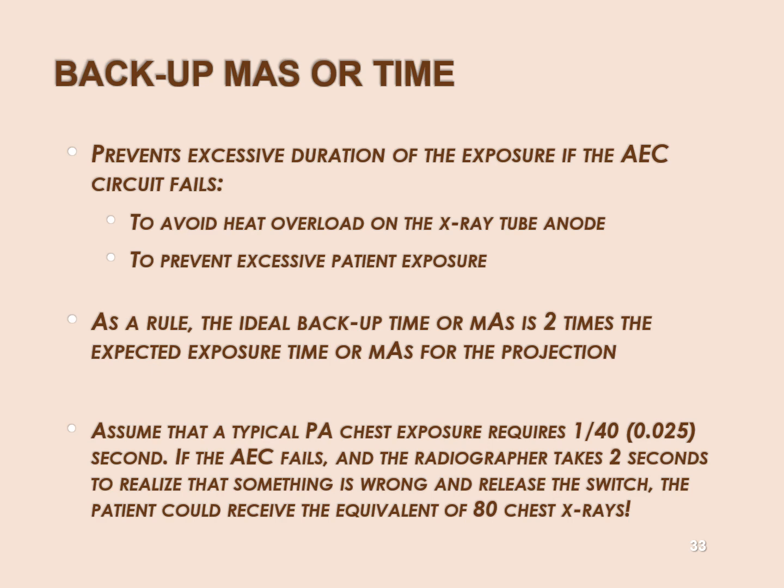So inadequate kV with too thick a body part, that's a recipe for disaster. Okay? You don't have enough penetration power, body part's too thick, no ions are being created in the chamber, no charges are being stored in the capacitor, so the exposure just keeps running and running and running until you get a clue and let your thumb off the button.